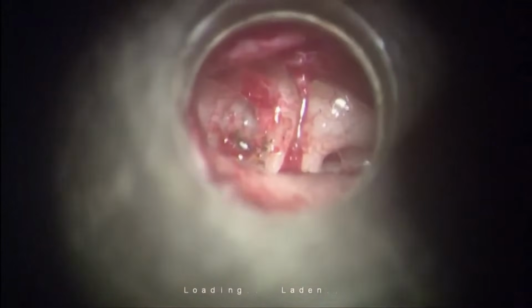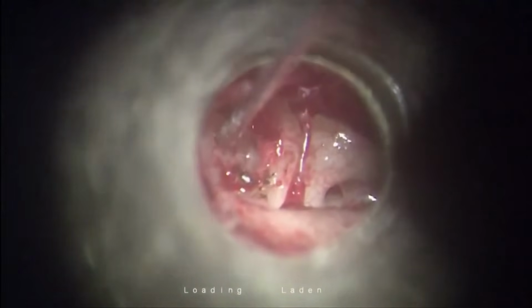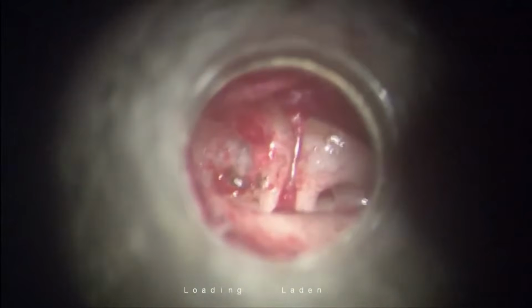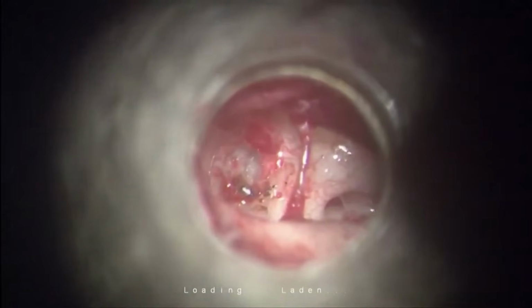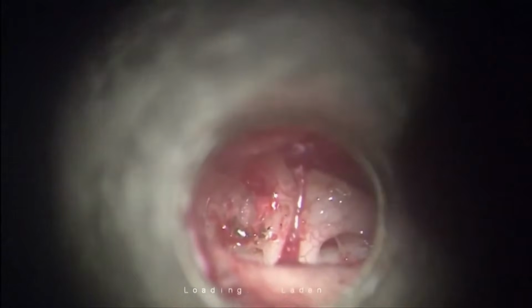Now, as I told you, this is like a video game. This is the safest in the beginner's hand, I would tell you, because using this laser rules out the possibility of mobilizing the footplate.